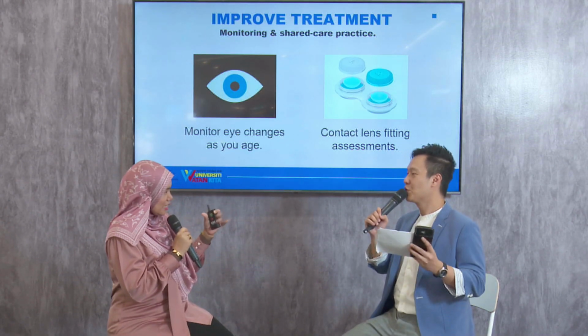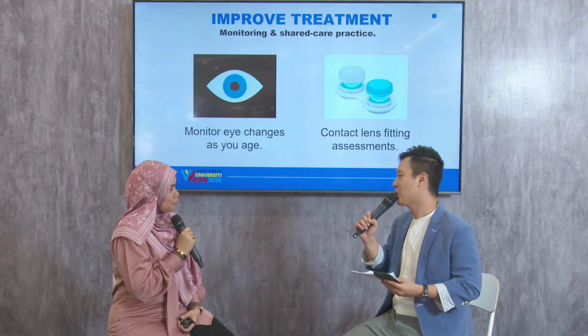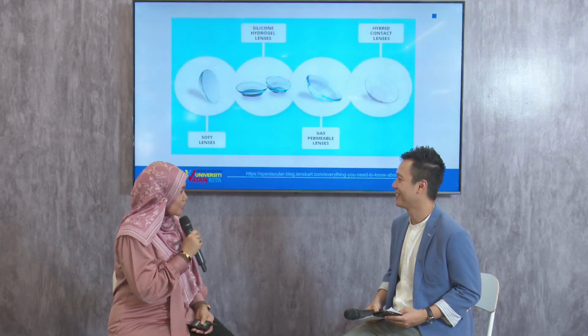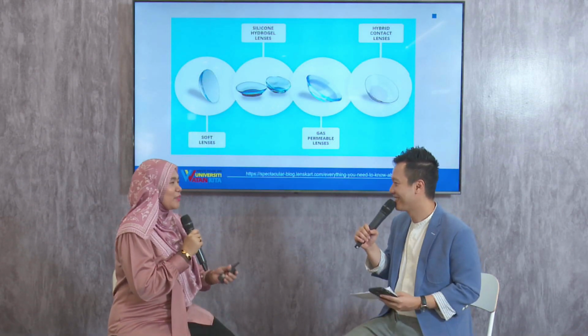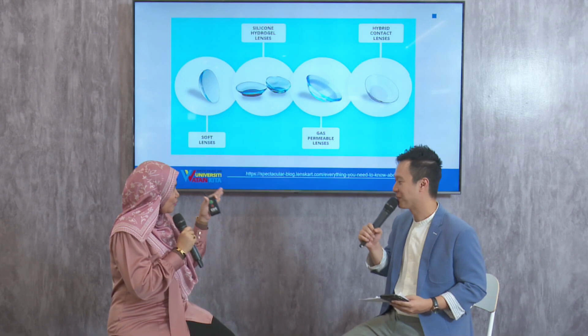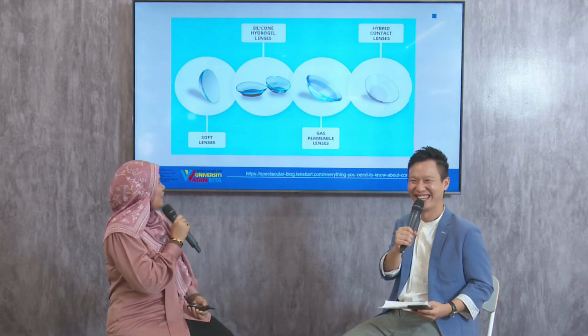fitting to assess. So if we go for contact lens fitting without undergoing this slit lamp examination, what are the consequences? Because with contact lenses there's no one size fits all. So therefore, we need to ensure that each contact lens fits well to the patient's eye. I have a few videos and pictures afterwards to see whether you really need to have the slit lamp eye assessment.